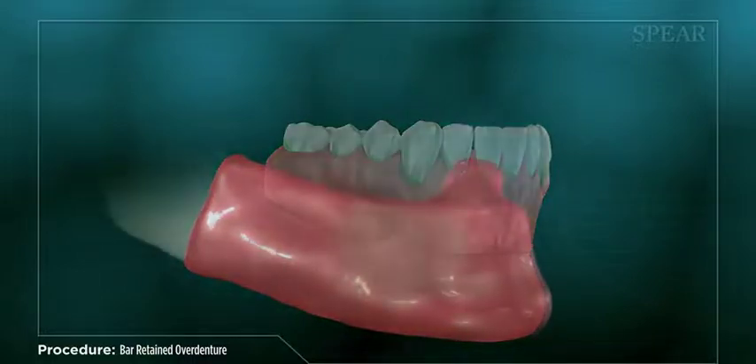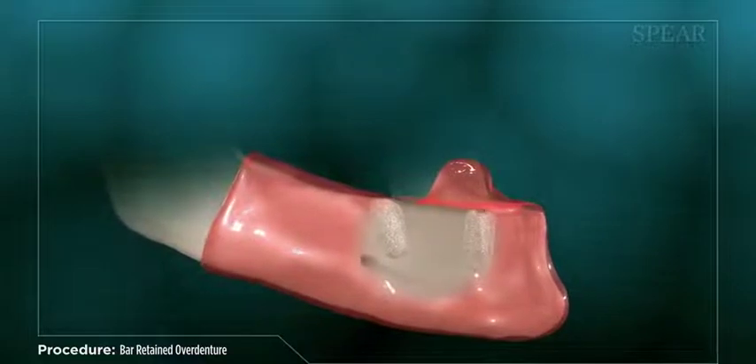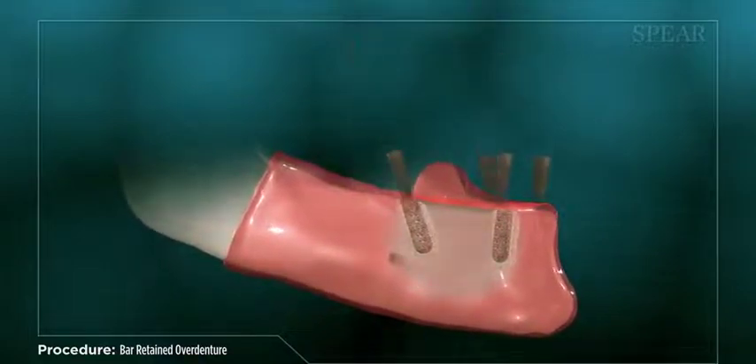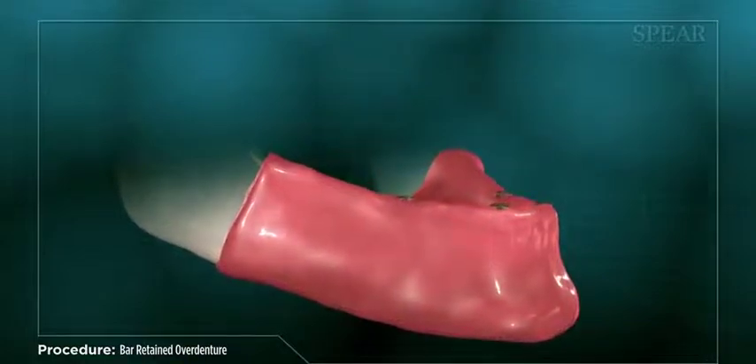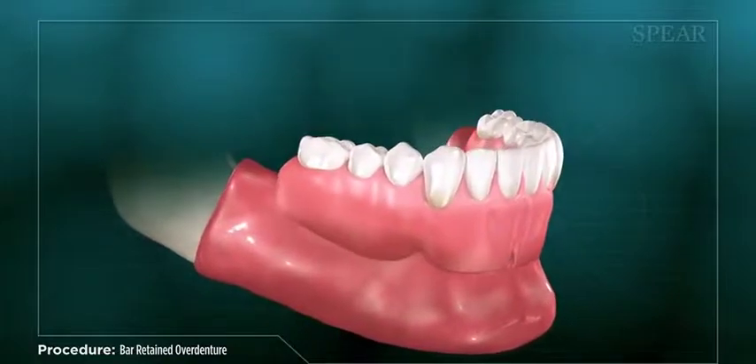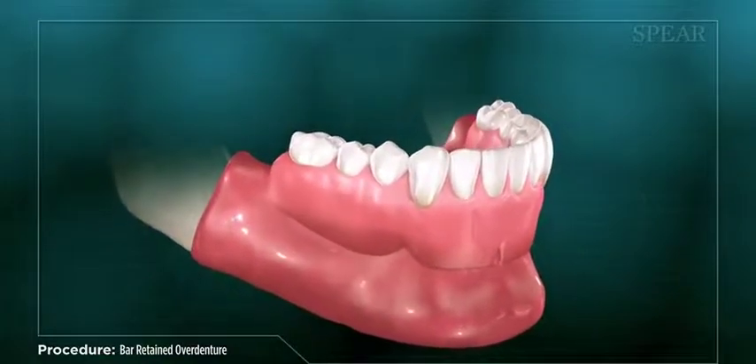Next, the area is prepared and your dental implants are placed. Special healing caps are placed over your implants while you heal. At subsequent visits, your doctor will monitor the healing process, letting you know when the area is ready for the next phase of treatment. You can continue to wear your temporary denture during this time.